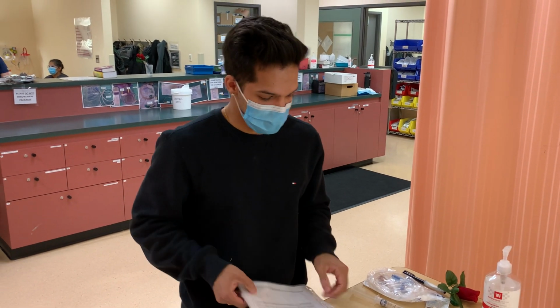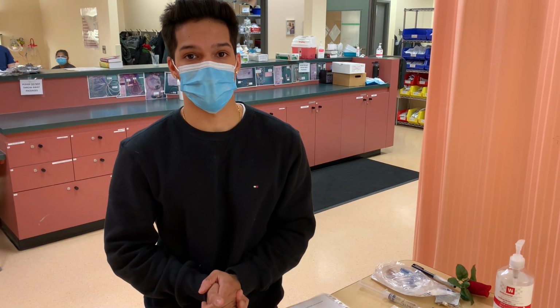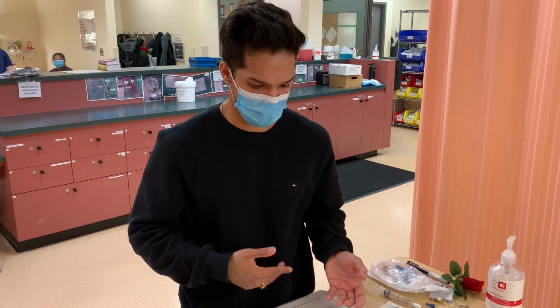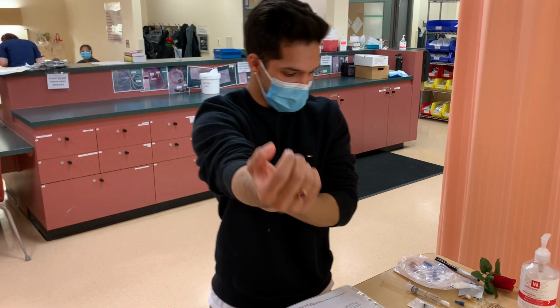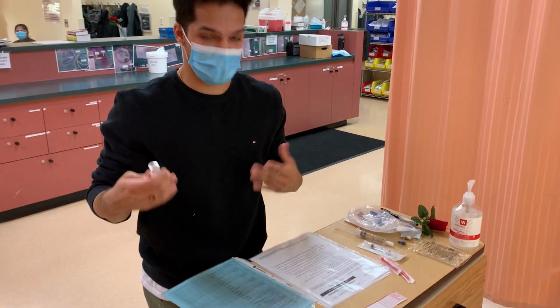Okay, so now that I'm done with that, and I did note that it's a high alert medication, for insulin I'm going to need a second nurse check to check over all my medications and my pump before I set it up. Okay, so now I can start pulling out my medications. Here I have my insulin Humulin R, and now I can do my first actual check.